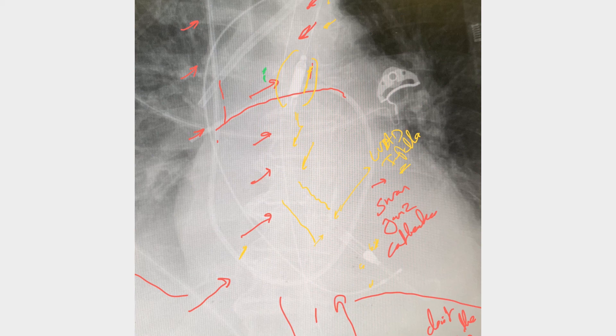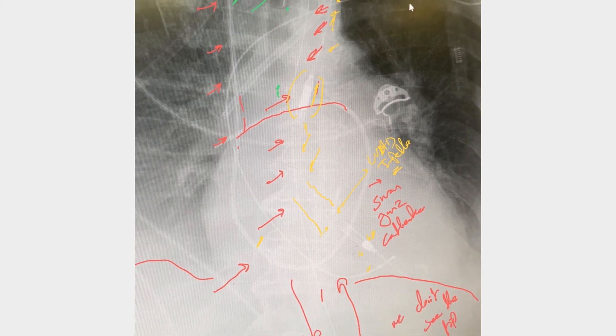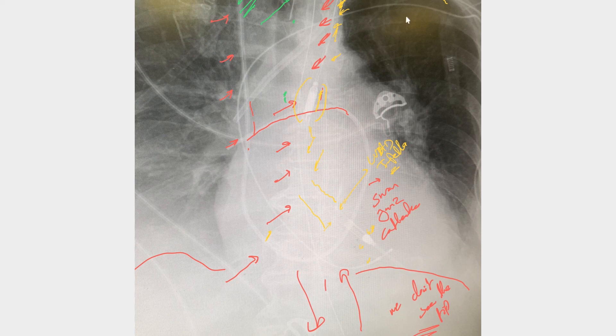The last thing to identify is this thick catheter ending at the tip of the superior vena cava, just above the right atrium. Whenever you see a thick catheter like this, this is a left IJ catheter and this is a temporary dialysis catheter. Go back and watch the videos on central venous catheters in general.